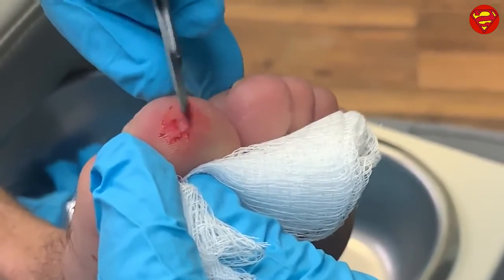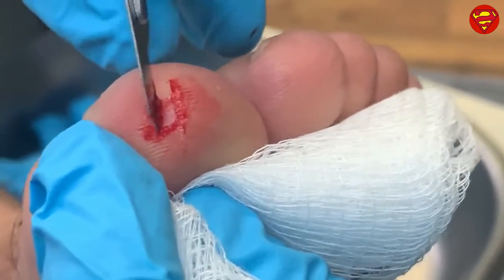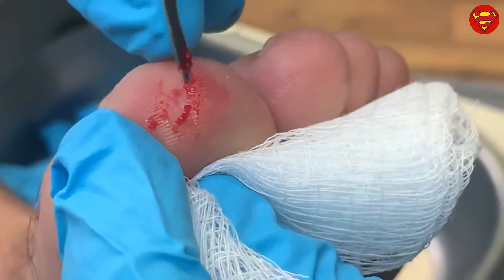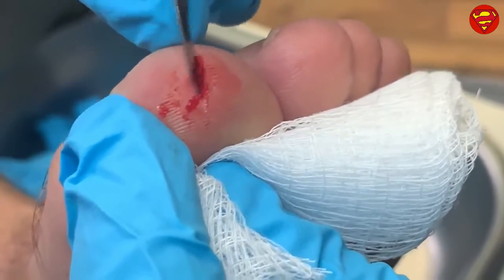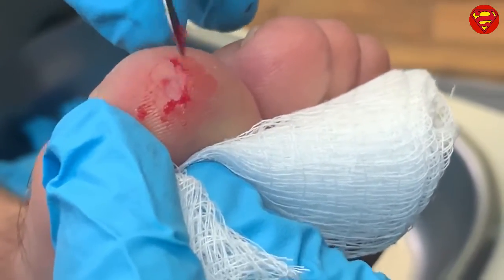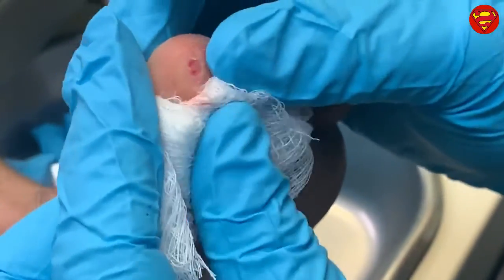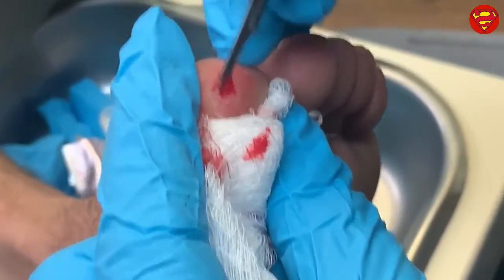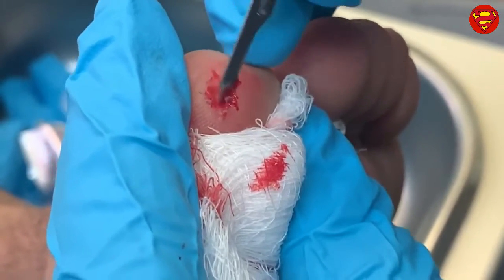See that layer? That's the one right there. See how it's white? That's the layer I want. Don't go past that. For those doing it at home. Mm-hmm, exactly. For all those DIYers out there. Yeah, I'll leave this up to the professional. I don't recommend bathroom surgery. Usually it ends up bad. Bad result. Hey, y'all, watch this. You hear it now? That's usually what I hear.